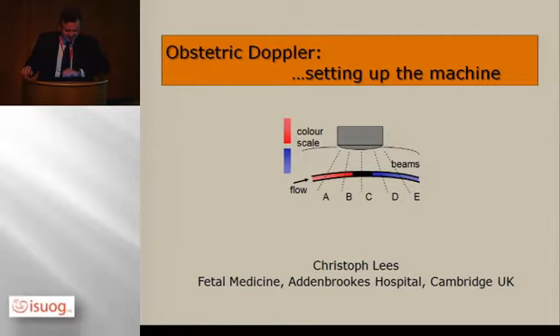It's a pleasure to be talking to you about the basic setup of the machine and really getting things ready for obstetric Doppler examinations. We've got a fantastic program today and tomorrow, but it's pretty important before you start Doppler. Many of you will be pretty advanced in Doppler. Some of you will be starting. Some of you will be using Doppler occasionally, but it is, we think at ISUOG, very important to have some standardization of how to do it. So I hope by the end of this lecture I'll have convinced you of the need for possibly a little bit more standardization and a little bit more teaching of how to do the Doppler.